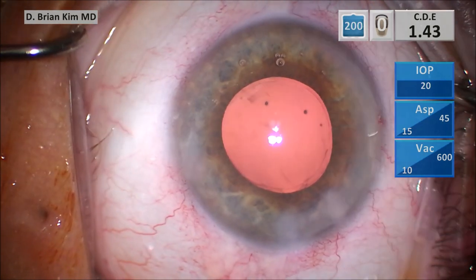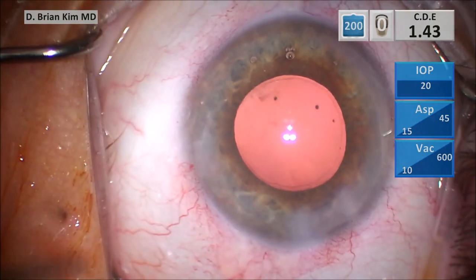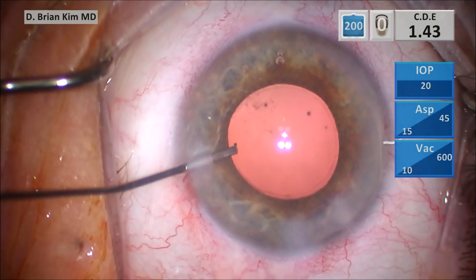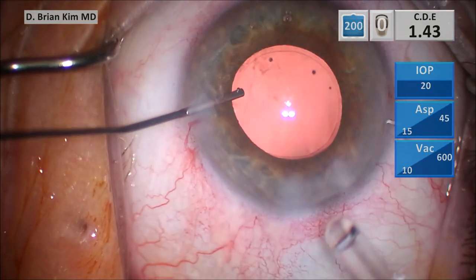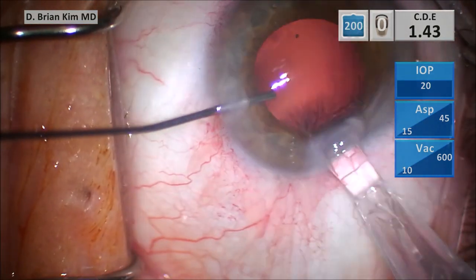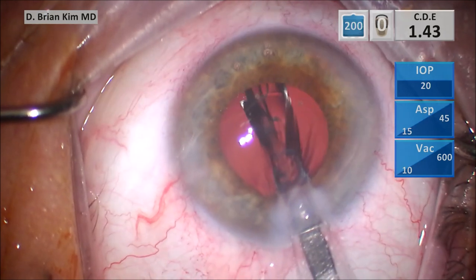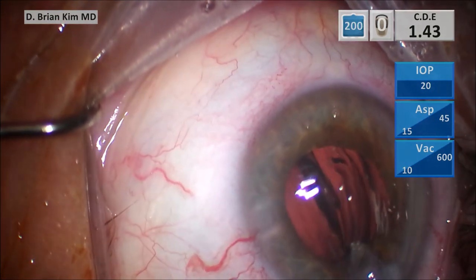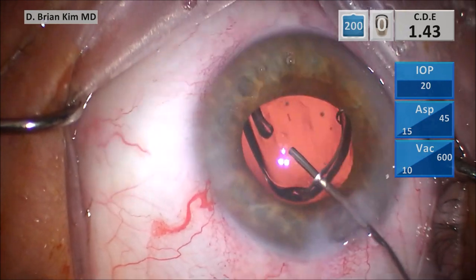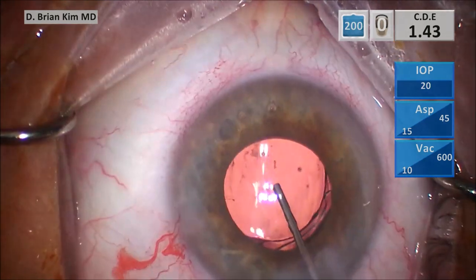Where should I put the lens? Should I put a three-piece in the sulcus? Should I put the three-piece in the bag? Should I put a one-piece in the bag? Because of the direction of the tear — it was oriented towards the periphery, not coming towards me, the ends of the tear going towards the left — I felt pretty confident the remainder of the posterior capsule was going to remain intact. So very carefully, I'm injecting the one-piece lens into the bag. Since the lens unfolds fairly slowly, I'm able to use a cannula to mechanically dial the haptics into the capsular bag, orienting the haptics 90 degrees away from the capsular tear.